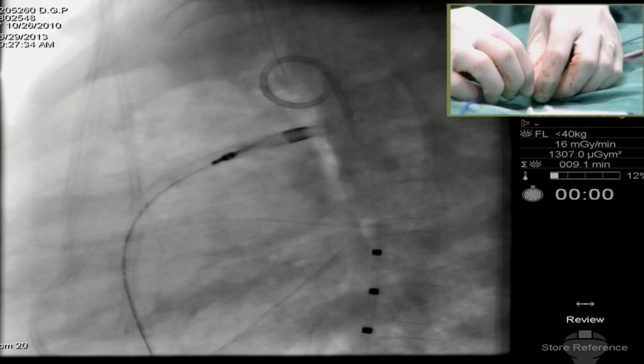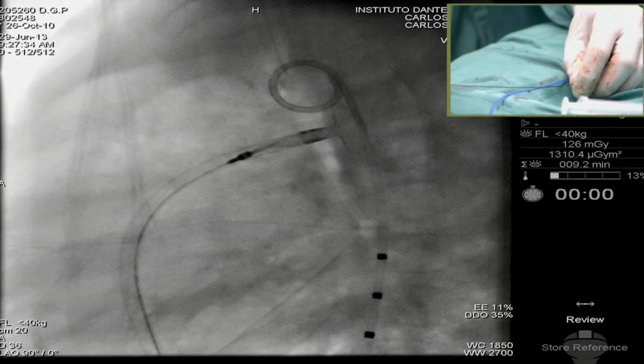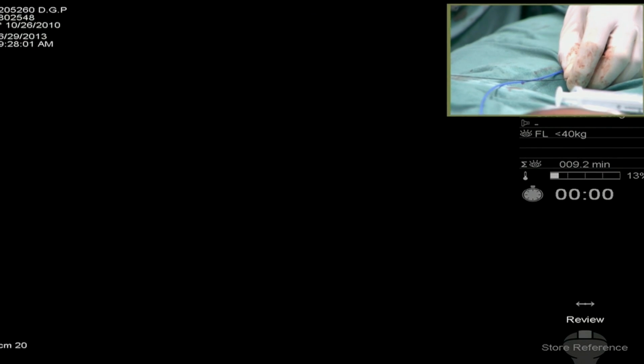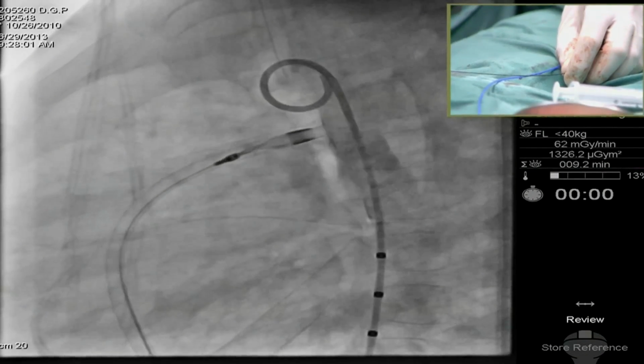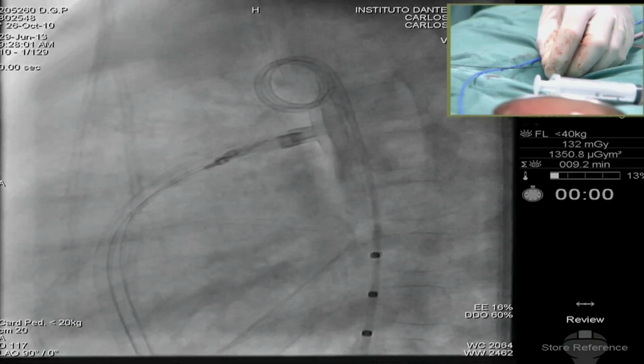Ready for the injection? The disc isn't flat. Get it ready. Let's go. Now a quick injection here. Inject. See, I think it's too big. Yeah. Next one is 15, not 10.